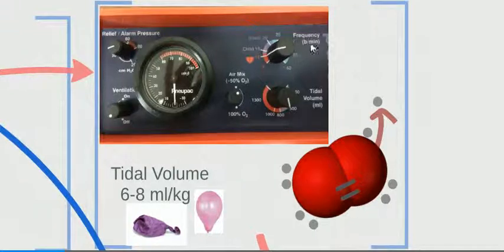The next one is frequency. You'll notice that if you look over here into the green, it goes up to roughly 40, right? It goes infant, and so on, up to 40. But these tidal volumes are so broad in their range and aren't able to be narrowed in to below child standards that we don't use this under anyone less than 12 years of age. It's just a little bit safer that way, and we have a high chance of maybe popping a lung or not setting it up adequately when we get ROSC on anybody below 12 years old.